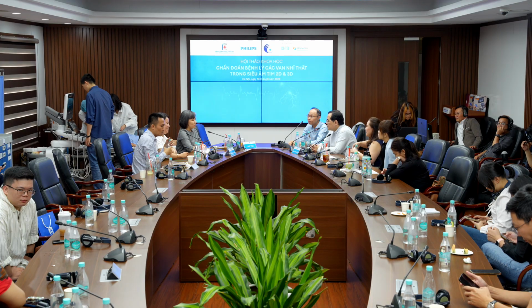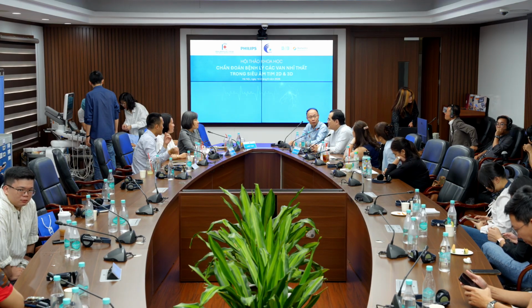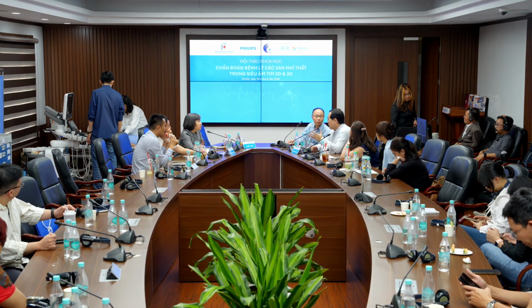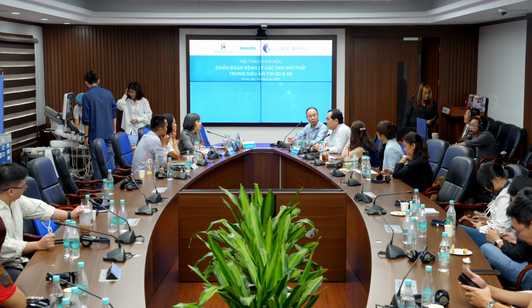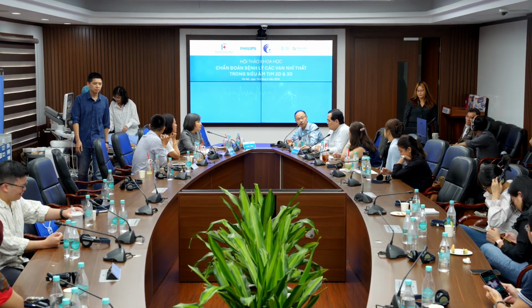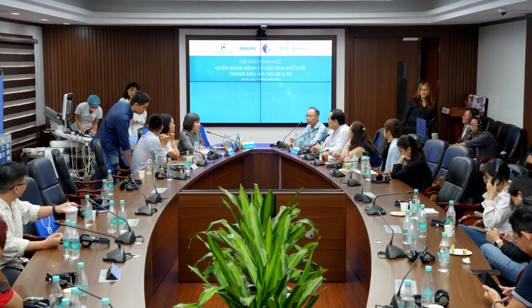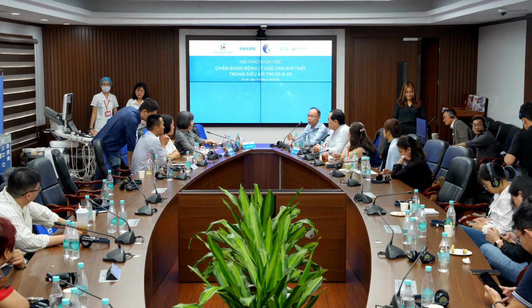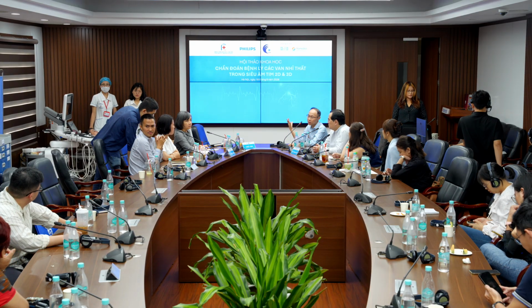Thank you very much. So you're thinking about athlete's heart. But athlete's heart usually has all the chambers dilated, and the diastolic function is supranormal. 100 kg, yeah, correct. It's all on the RV. All the stress on the RV, LV as well, as opposed to your LV assessment. Everybody is mainly seen in the LV.